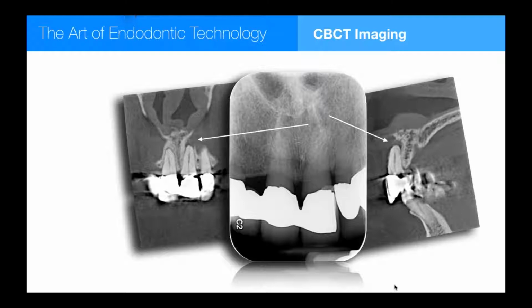We've often thought that it would be so beautiful if we could do root canals and understand everything about the anatomy before we got in there. And we kind of said that because it's, you know, like an unrealizable dream. But now that's the age we're living in. I don't go into root canals without knowing where every primary canal, every branch, every fourth canal, even every lateral canal in most cases is before I even touch the tooth.